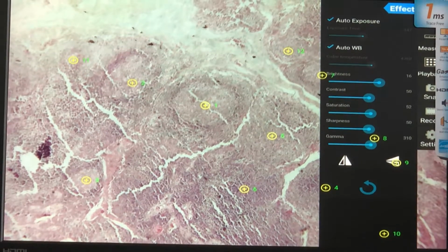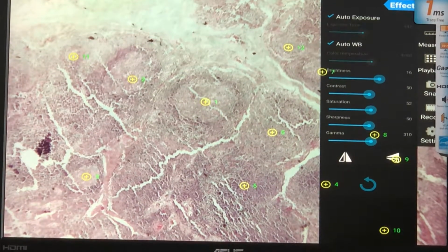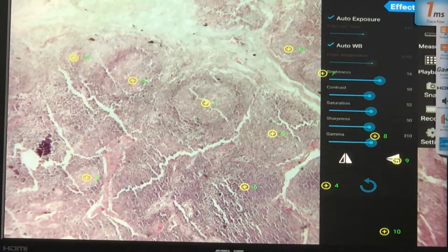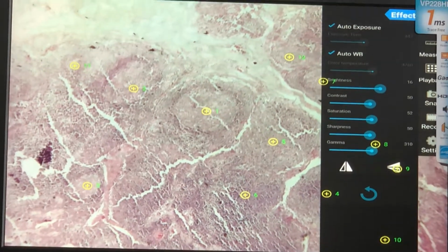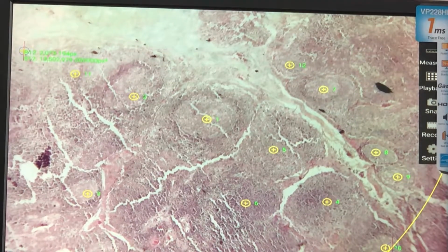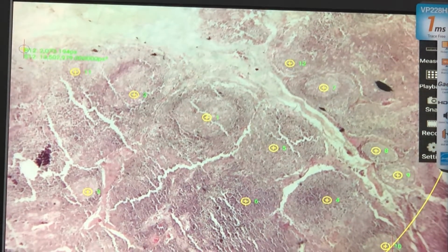So your basis for this is you will see the entire fields filled with lymphoplasmacytic cells, some form follicles. However, the follicles not only fall on the side, sometimes they fall on the center. Like this one. If I will mark this one in the center, this is the lymph node. I'm sorry, it's so big. Anyway, this one, the capsule here, there's our lymph node. You see the fibrous capsule.